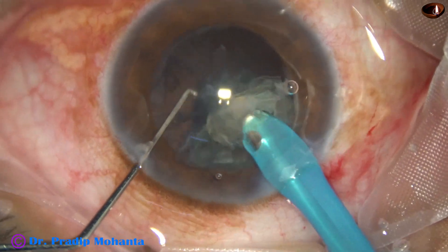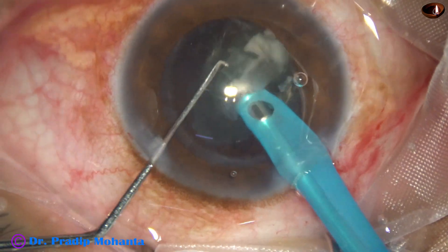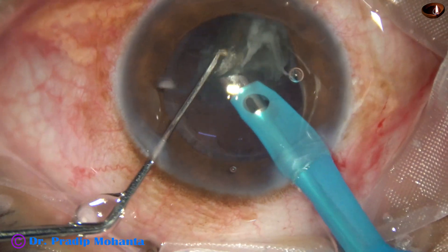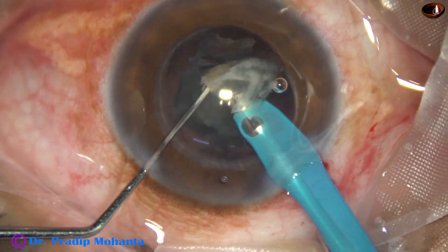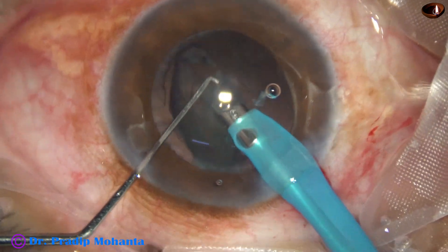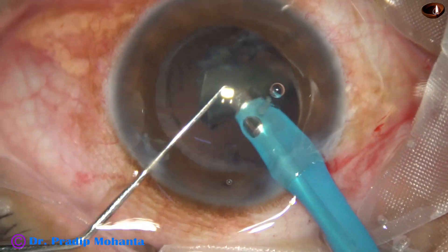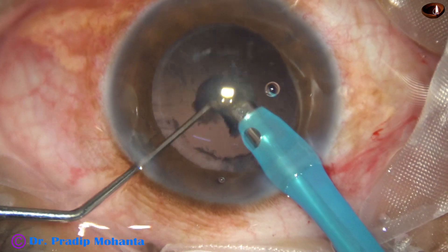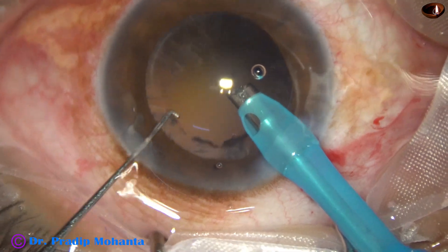This is the last but one piece. During emulsification of the last piece, the parameters are reduced — vacuum 350 and flow rate 35. The incidence of posterior capsule rupture is much lower nowadays in my hands because I take these precautions of lowering the parameters during the last piece and emulsifying it slowly.